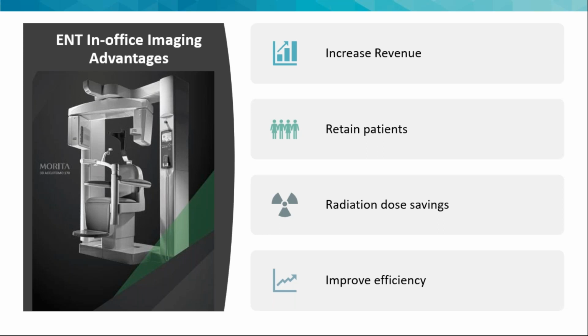That's correct. CBCT is 1/5 the dose, or approximately 80% savings. Using real numbers, you're comparing about 0.17 millisieverts for a typical ENT CT scan of the sinuses to around 1 millisievert for a similar CT scan on a conventional CT scanner. So a lot of different ways to compare, but absolutely a dose savings every time.